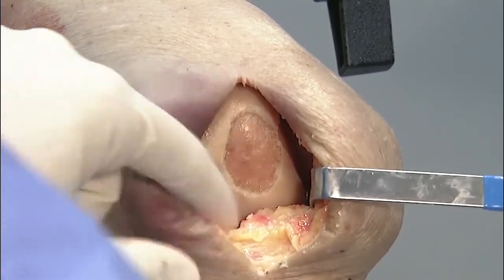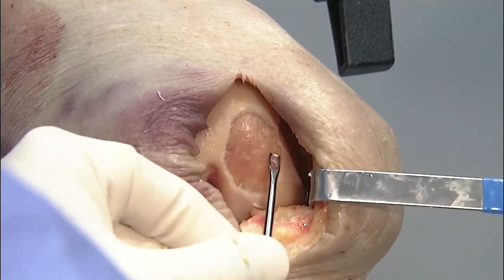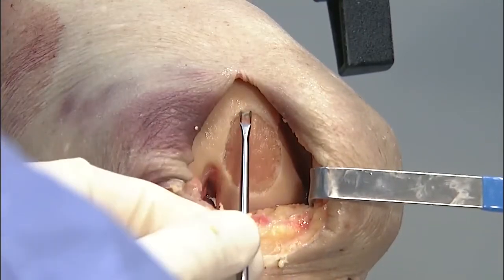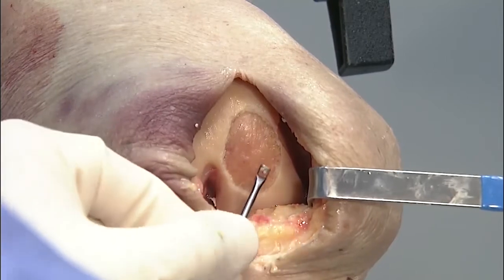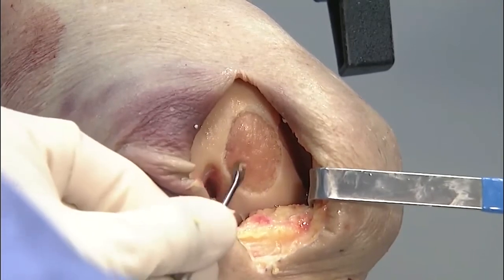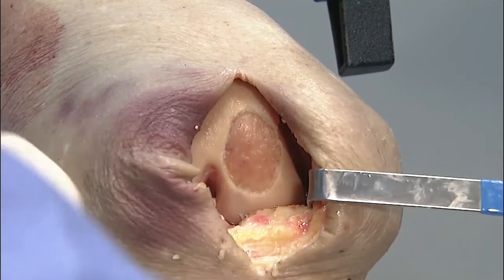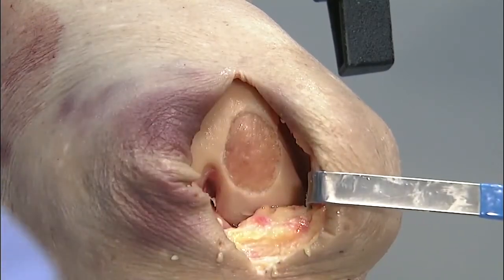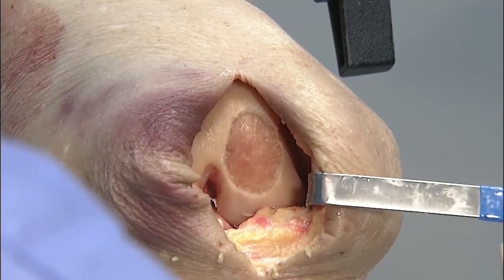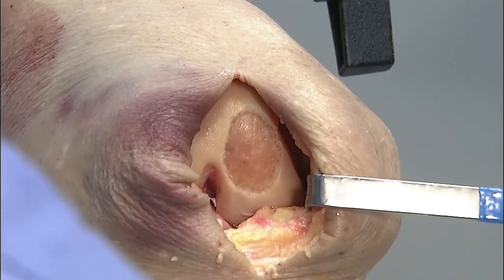So IV, it can also come topically that you can apply it, but we run 1 gram IV before incision. And if you're going to use a tourniquet, then you can administer a 2nd gram IV when the tourniquet comes down. If you use it for your osteotomy patients, it's just amazing the difference. They don't get that soft tissue bruising that they would typically get. So I think it's definitely been an advantage in my practice. You give that at the same time you give your prophylactic antibiotics? Yep. We run it through the checklist with anesthesia.